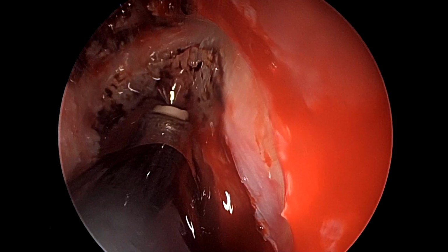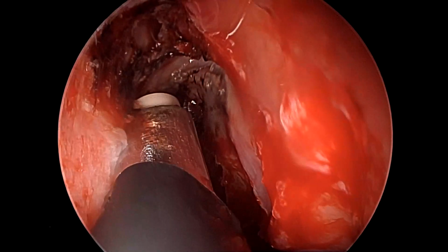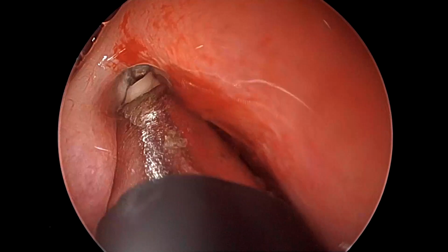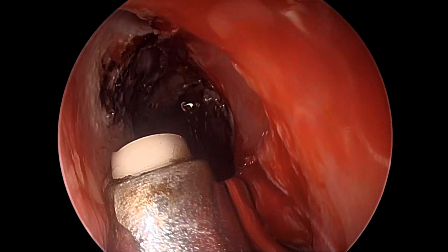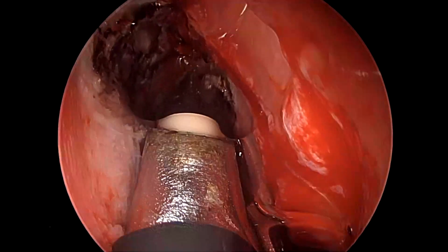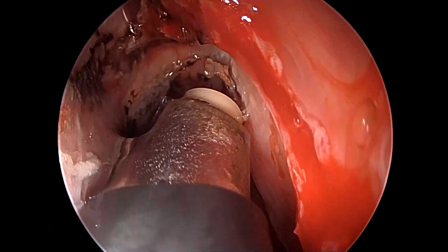This step can be achieved either using a bipolar forceps or the coagulation wand. The normal bipolars don't really go there very well, so one has to use endoscopic bipolars. But the advantage with the coagulation wand is that we get irrigation, suction, coagulation and ablation, everything in a single tool, and thus it allows us even a two-hand technique very easily without resorting to more hands inside the surgical field.